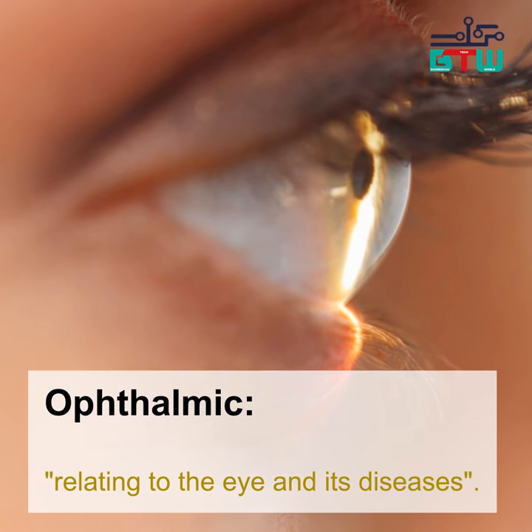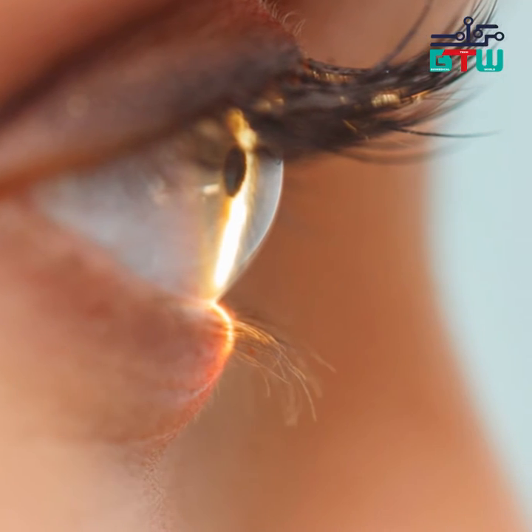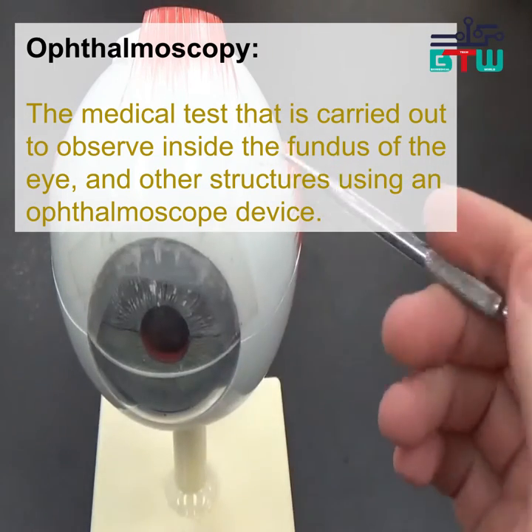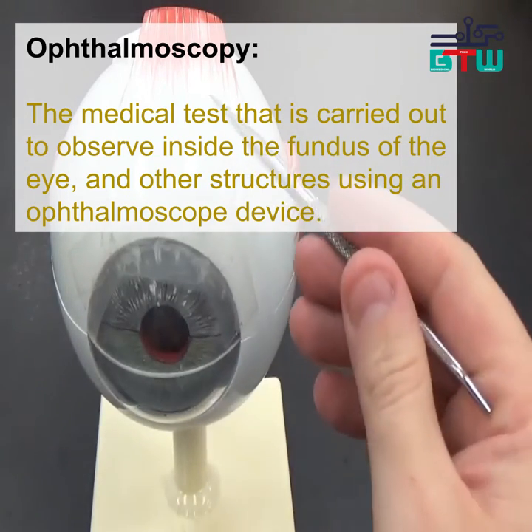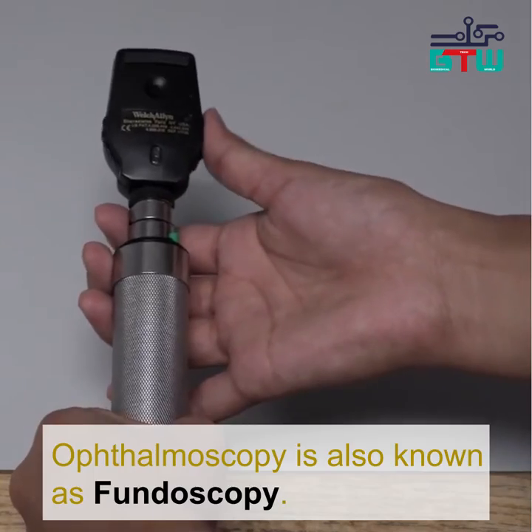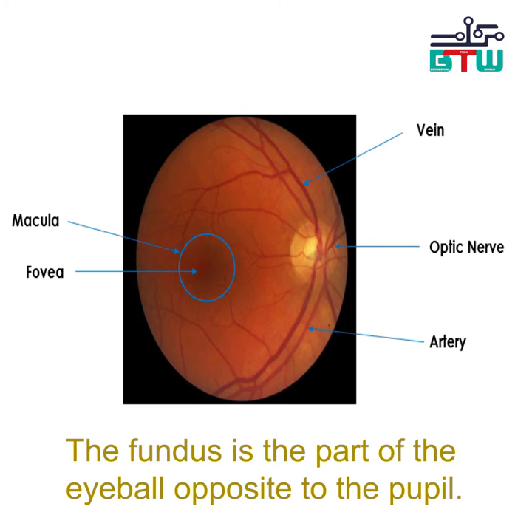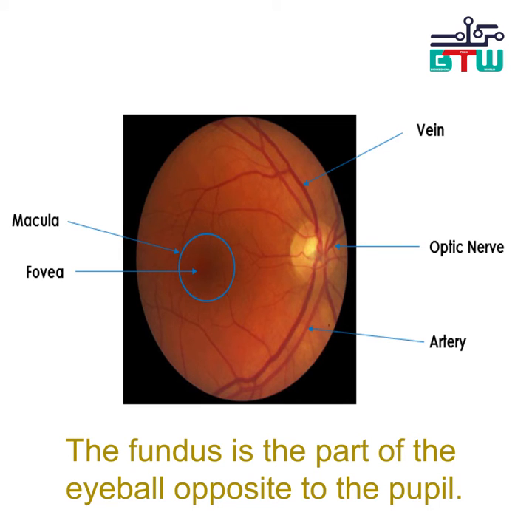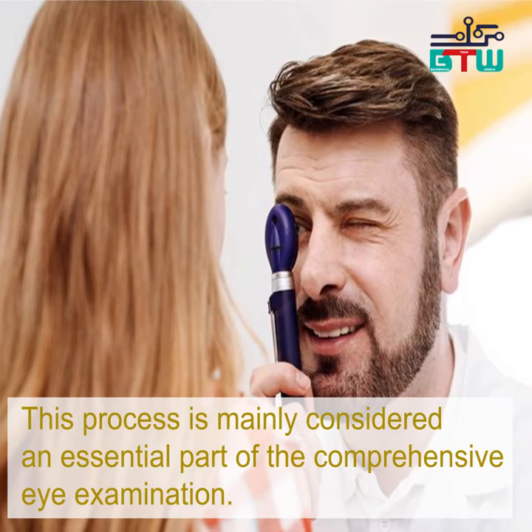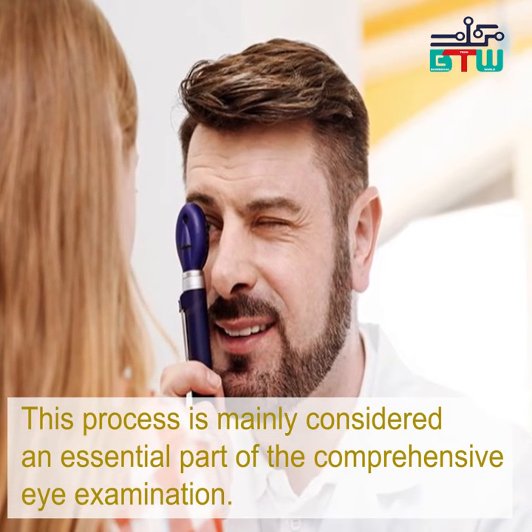The term ophthalmic means relating to the eye and its diseases. Ophthalmoscopy is the medical test that is carried out to observe inside the fundus of the eye and other structures using an ophthalmoscope device. Ophthalmoscopy is also known as fundoscopy. The fundus is the part of the eyeball opposite to the pupil. This process is mainly considered an essential part of the comprehensive eye examination.